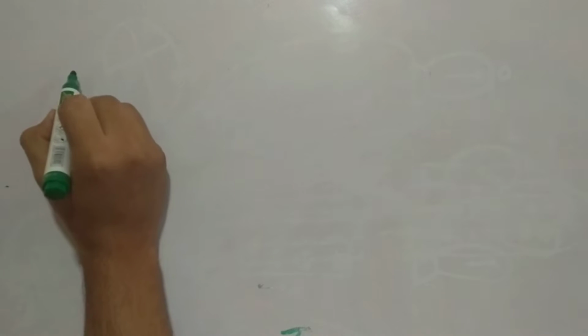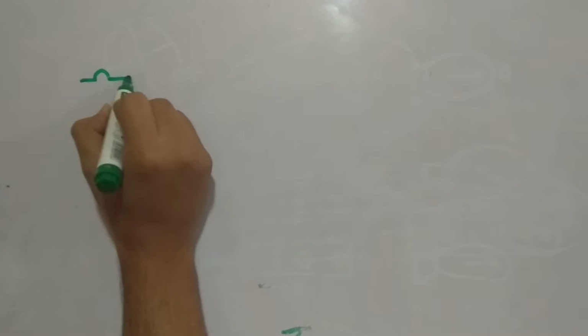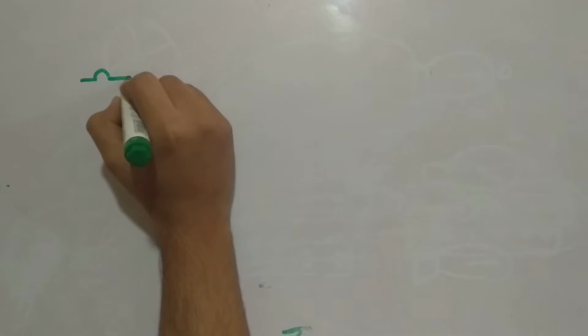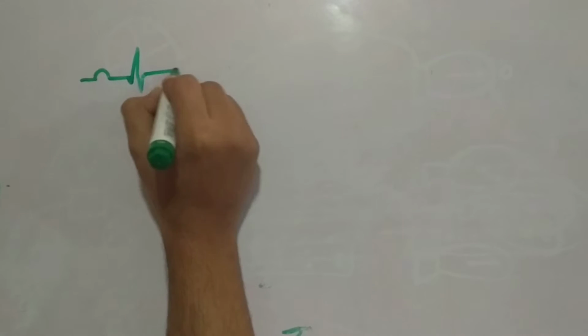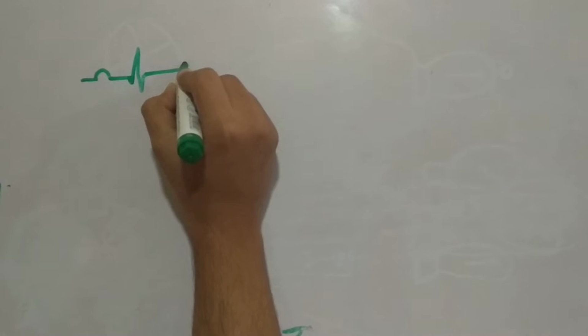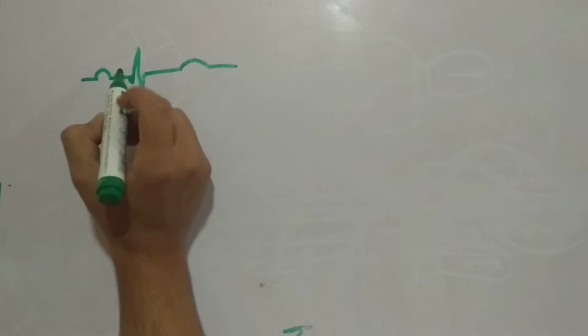Okay, in this video we will learn the basics of ECG and we will note why there is basic positive or negative deflection we find in PQRST in case of ECG. Taking the simple example, suppose this is a normal ECG, then here comes your P wave and then PR segment and slight Q deflection, R, S, and here's your ST segment and here's your T, isn't it? So what you can understand from here is that always look at the PR segment.